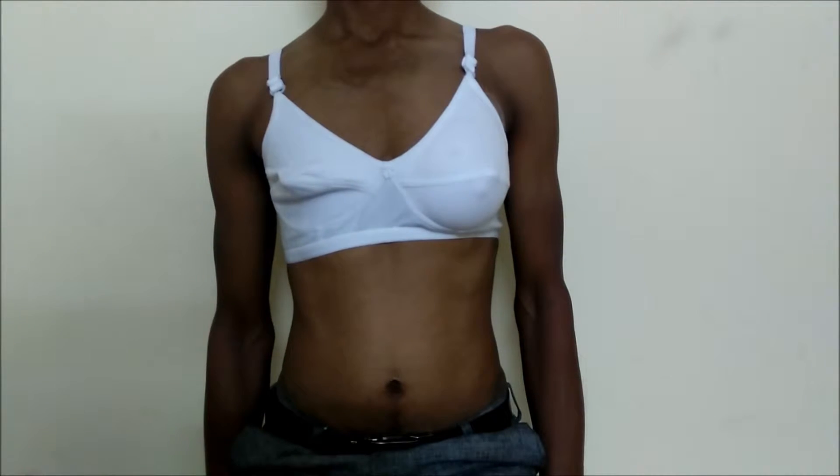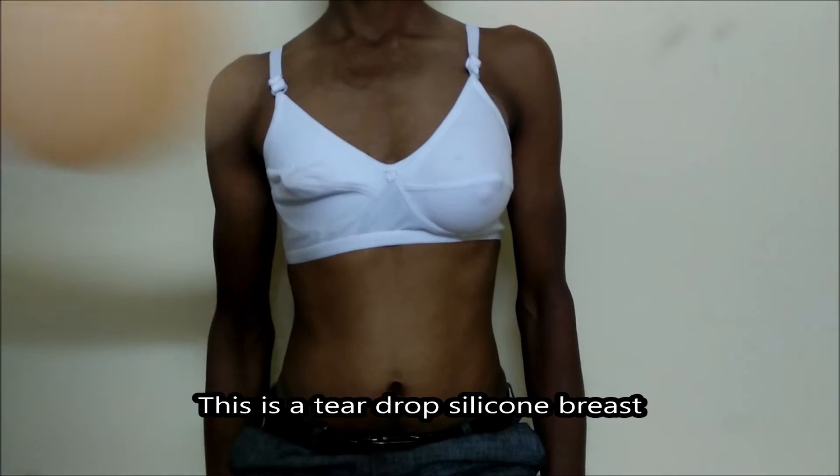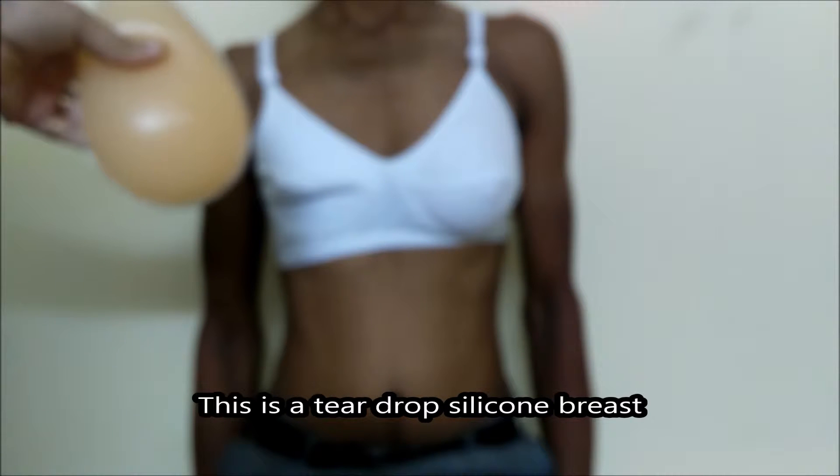Good morning everybody. Today we will learn how to wear a silicone breast. We have taken a male subject — you can see the left breast is there and the right breast is missing. For the right breast, we will show you the demonstration. This is a teardrop shape breast.